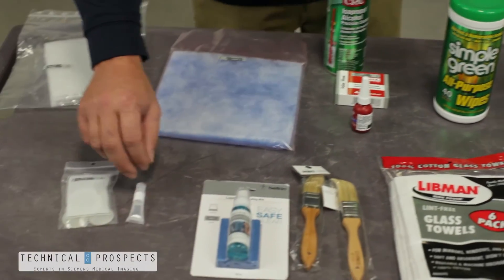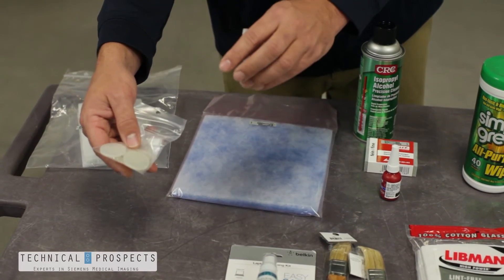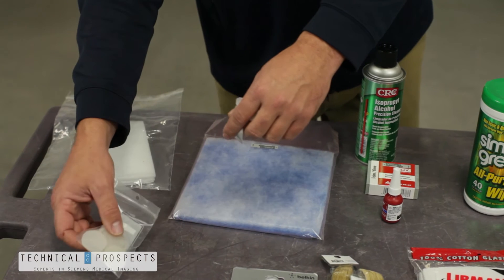Part of preventative maintenance is using silicone oil and disc assemblies for your high-voltage connections to keep everything running smoothly.